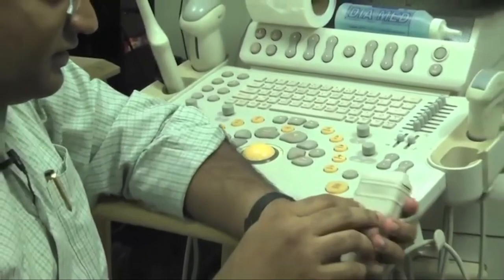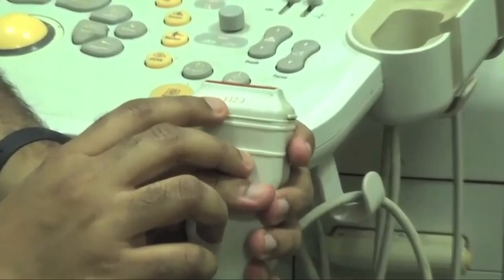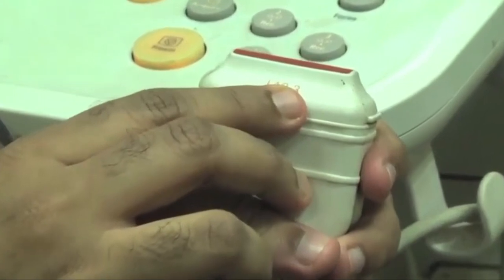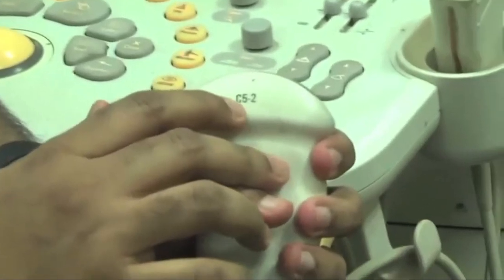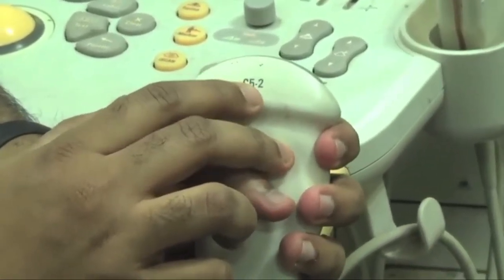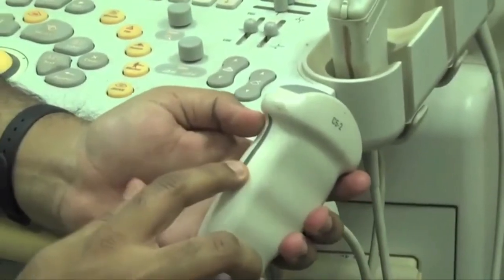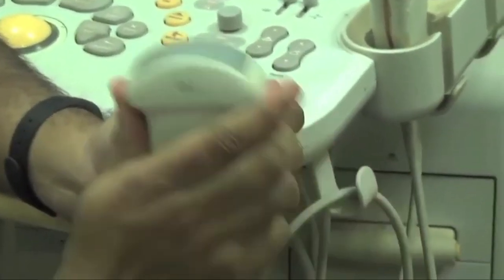Now one particularly interesting thing I would like to show you is the number for this probe. This is L123, which means this is a linear probe of 12 megahertz, and this 3 is a number which specifies the generation or iteration of this particular probe under development. The second probe which I would be showing you is a curvilinear probe. This is a C52, so it is a curvilinear probe at 5 megahertz and the second generation of that probe. You have a similar notch over here which signifies the left side of it, and it's quite an ergonomically designed one, so that you can hold it very rigidly in your hand.